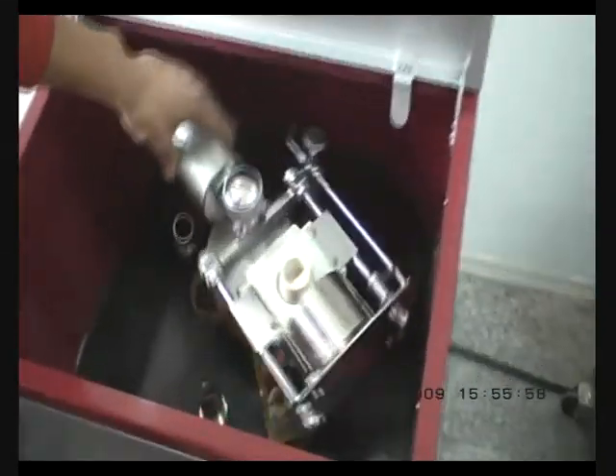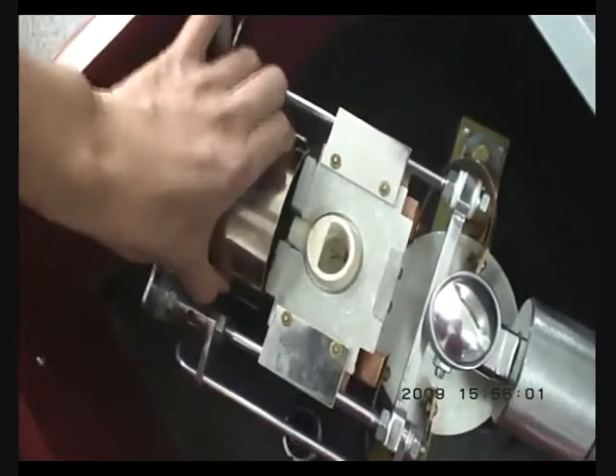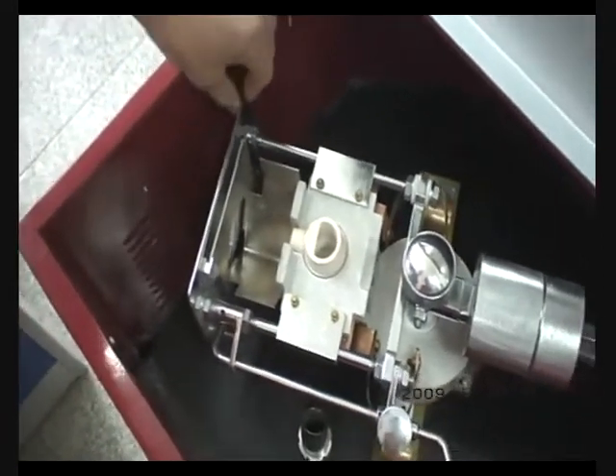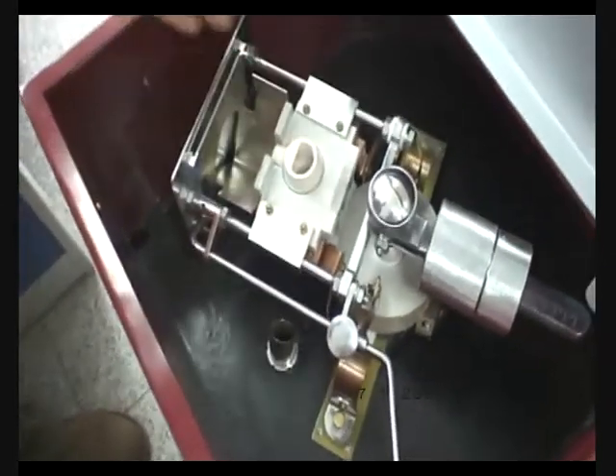Now you can take out the casting ring. Please rotate the machine to this position, because the air is coming out from here, so it's good for the cooling.